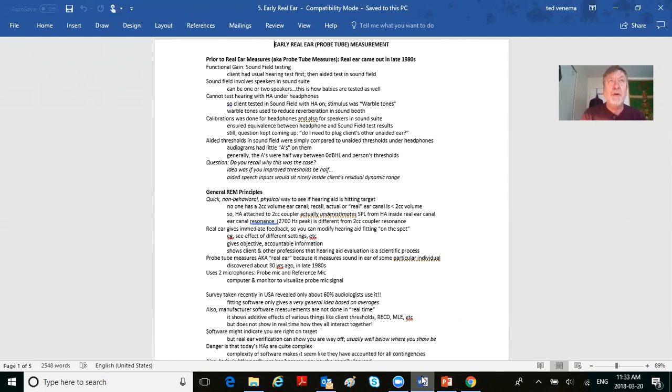History is very important. If you don't look at history, you're condemned to repeat it, okay? As we said in fitting methods, they came from Lybarger's half-gain rule. They all were born from that. Well, real ear today was born from yesterday's real ear. Today's real ear looks only at output.